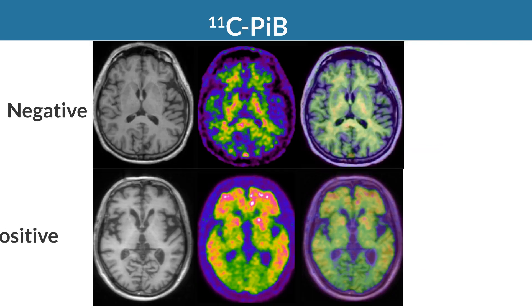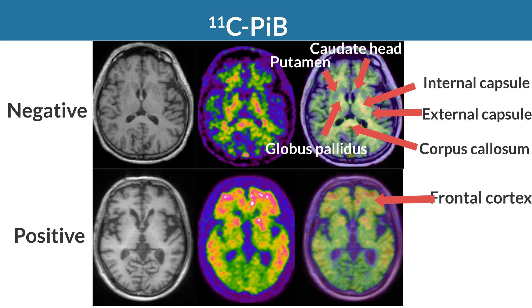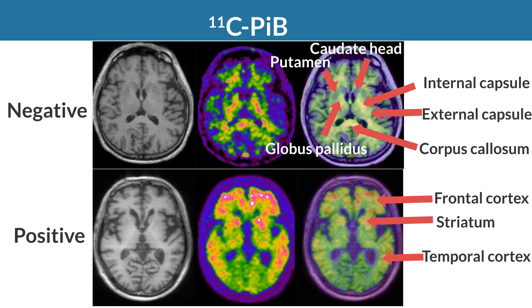At the basal ganglia level, in a negative case the internal capsule and corpus callosum show high accumulation, while striatum shows low accumulation. Globus pallidus shows higher accumulation than striatum because of higher white matter content. In a positive case, high accumulation is observed in frontal and temporal cortices and striatum, while occipital cortex shows relatively low accumulation.